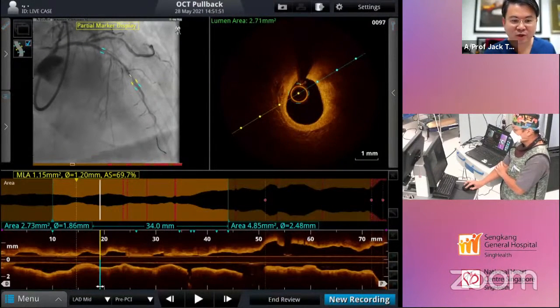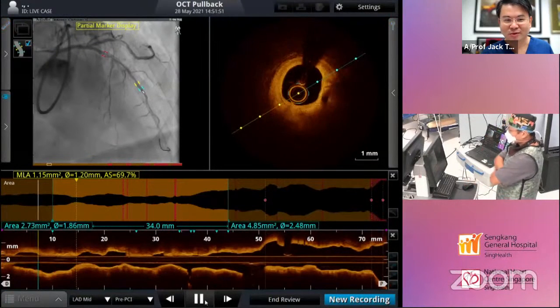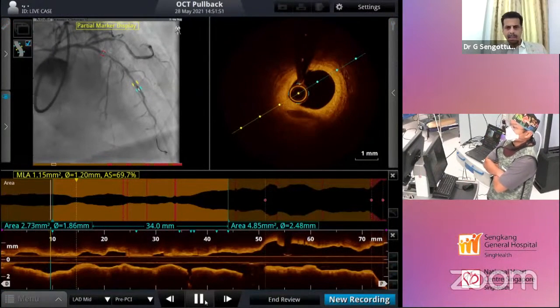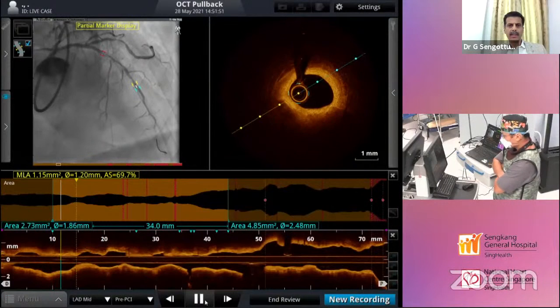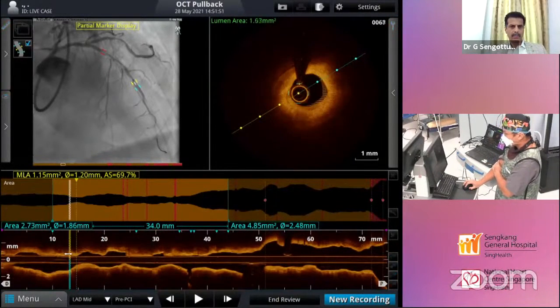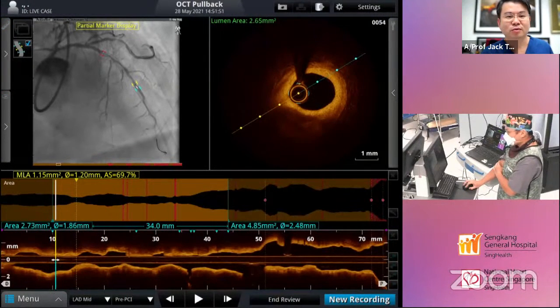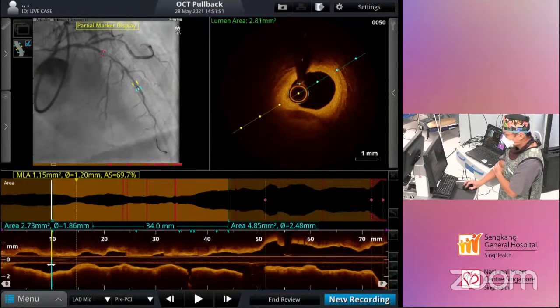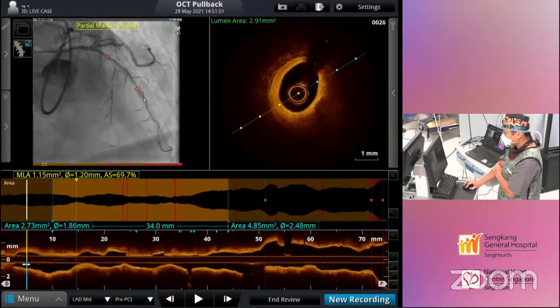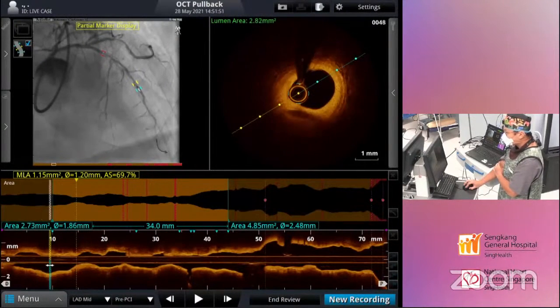Thanks. Any other points of view? Anyone? Before we hear from Dr. Pham what he wants to do. Is there a good landing zone, because of the distal landing zone? Okay, here it looks good. So, Chiang, you think the landing zone here is good? Where the co-registration shows there's no normal vessel. It's all diffusely diseased. So this is probably as good as we can get somewhere around here.